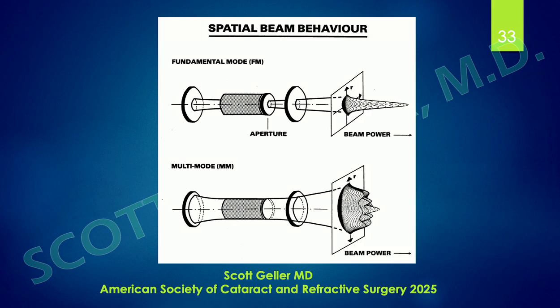So let's go into the so-called spatial behavior of laser beams. And this is important because not every laser has a perfect beam. And that's important when you're working inside the eye. So we have what's called the fundamental mode.